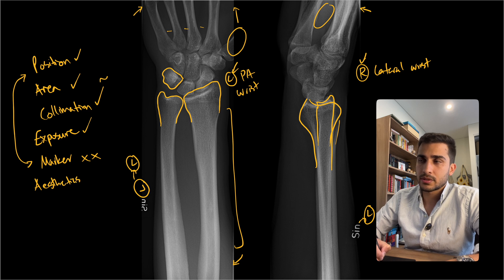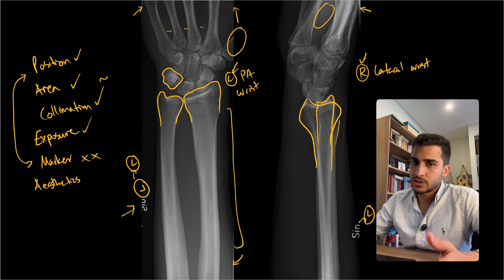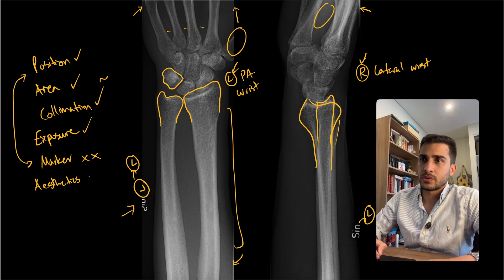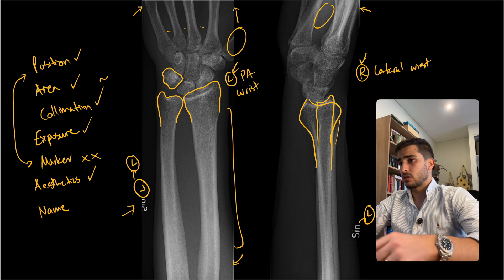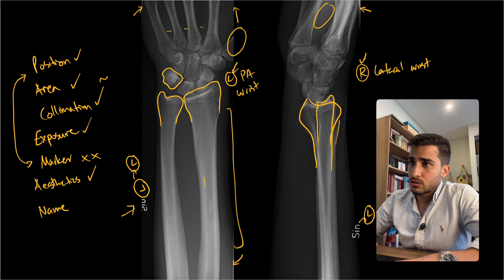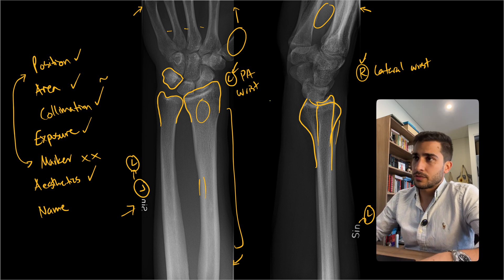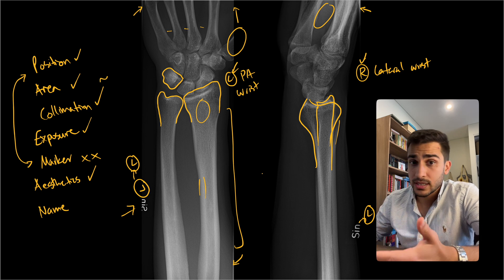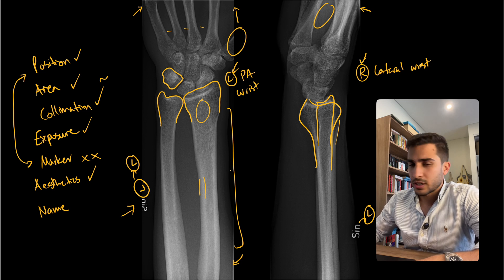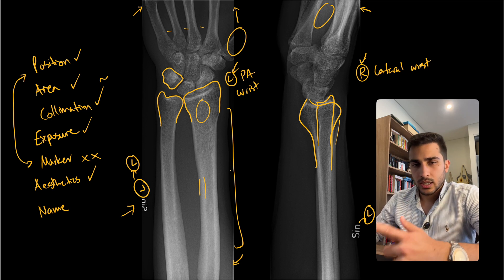For aesthetics, apart from the markers causing distractions and the very long but thin collimation, the positioning is excellent, exposure is good, and there's no rotation or tilt — so overall aesthetics is quite good. There's no patient name or identification for anonymous reasons. In terms of pathology, it looks like a pretty normal x-ray with a nice thick cortex visible and no fractures or dislocations. The key takeaway here is to pay attention to those markers — this is something you'll come across quite a lot on clinical placement.